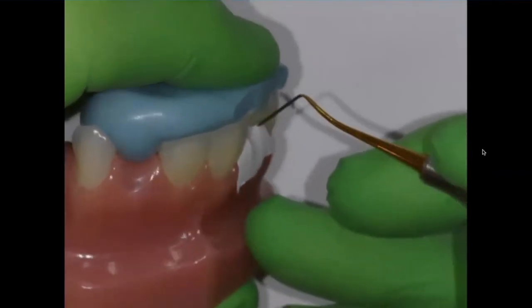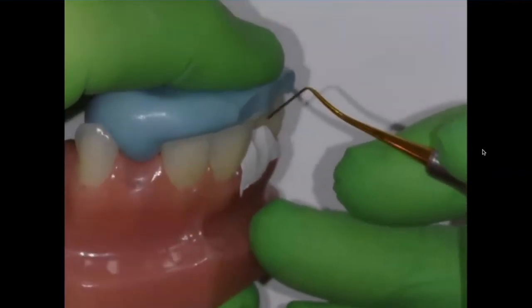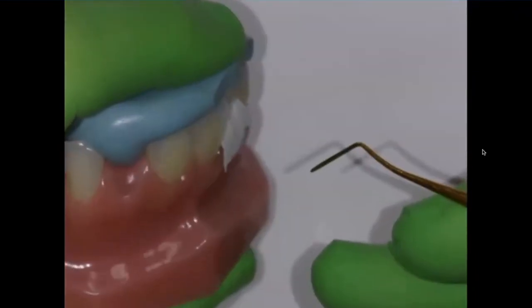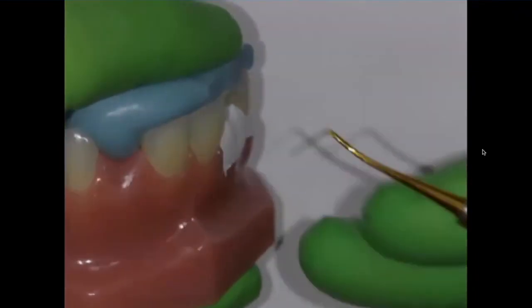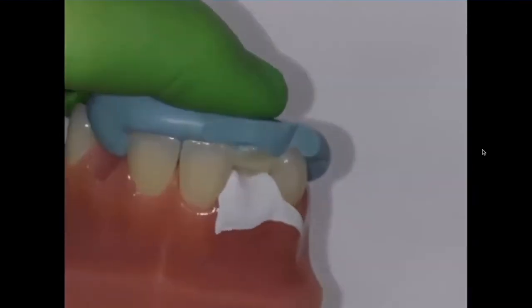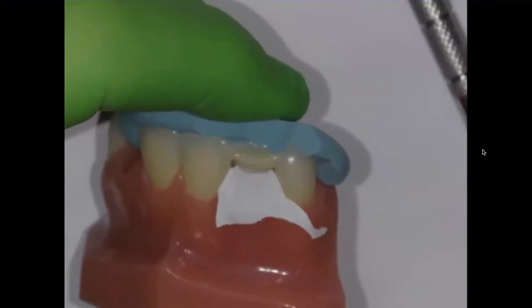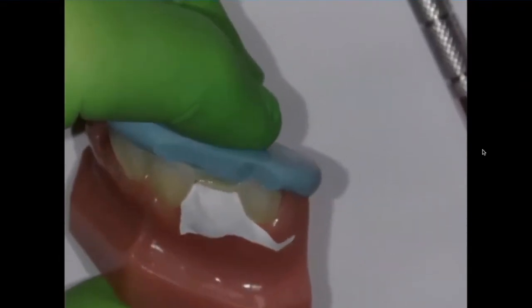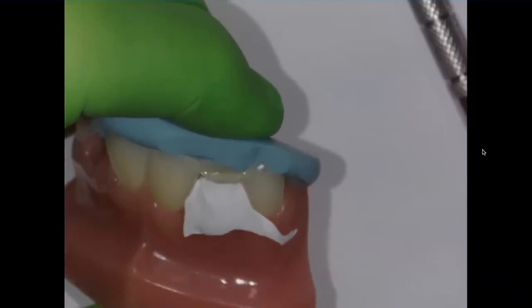I want to make sure — last thing — that I'm leaving space for that micro fill composite along the facial. So as I look from the proximal, making sure that it's not overextended facially — it'd be something like that. I'm going to cure that for 10 seconds. I've gone through with the IPC to make sure that the embrasures are open.